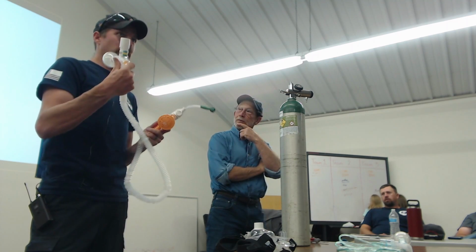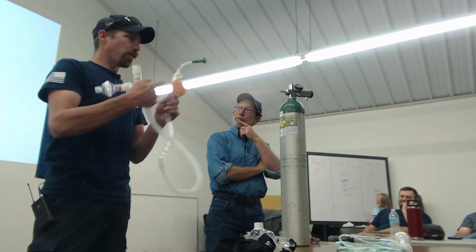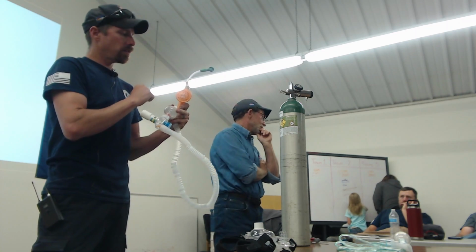So going back, since we covered the PEEP acronym, what's the FiO2 acronym? What does that stand for? Fraction of inspired oxygen, yes. So that at the 30 setting, I said 15 liters a minute, 125, a total of 140. That's at 30. So that means we are taking, what is our normal atmospheric oxygen? 21%. So at a 30 setting, we are delivering to the patient a fractional oxygen of 30% instead of the 21% that we would normally be used to. Okay? This has just 3 settings, a 30, a 60, and a 90. Again, start at the low end, and we're going to work up as the patient needs.